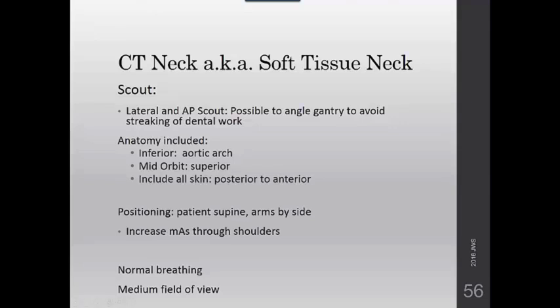This is 4071, positioning and anatomy. We are still in lesson 1, the brain and neck, and today we're going to talk about our 7th topic, which is imaging of the neck, and we'll conclude that with CT of the brain with and CTA of the brain with contrast.